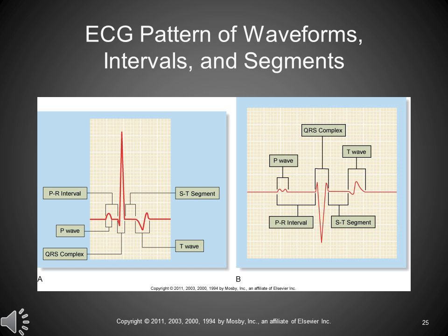You should be aware of and know the parts of an ECG now: the P wave, the PR interval, the QRS complex, the ST segment, and the T wave. Okay, various examples of recordings, even though the waves and the waveforms may appear a little different depending on species, depending on positioning, depending on even how you set up your ECGs. You should have P waves. You should have a QRS complex. You should have an ST segment. You should have a T wave. All the sections, all the waves, all the intervals should be consistent throughout an ECG for all species, unless you have some problems.